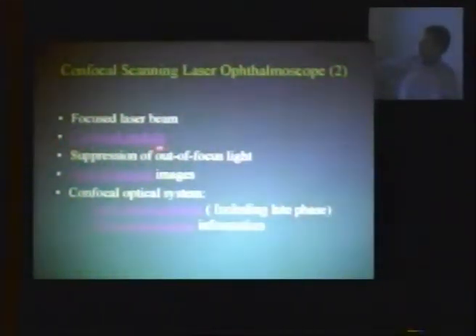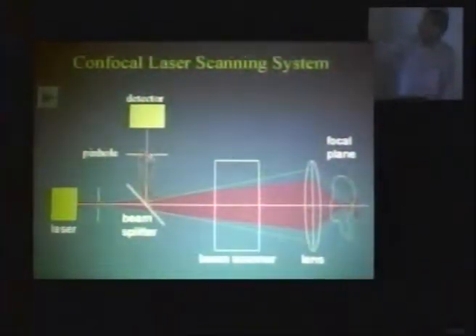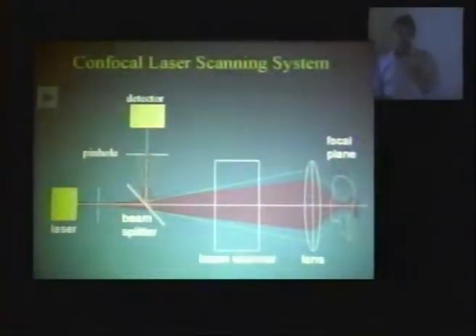Number two, what does it do? It has a confocal pinhole. That is the secret of the system. The fact that only images from here, only this focal plane, only that reaches the detector. Everything that is out of focus from here or from here does not go inside the pinhole. Very small, 30 micron pinhole, it limits the information. Only what is in focal plane. That is why you get sharp focus and high contrast. The information that is not here, everything from here or from here, does not reach the detector. Okay, this is technical, but it's important to understand the difference.